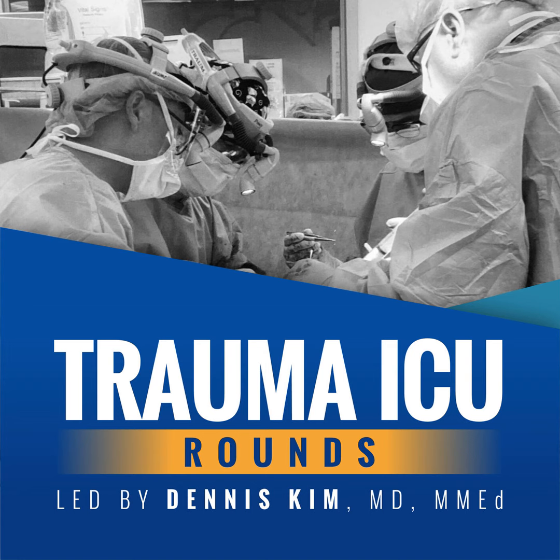So just to summarize before we go into the phases of a mechanical ventilator breath, the respiratory equation of motion is a great way of thinking about the variables that are involved in delivering or generating a positive pressure breath on the ventilator in order to ventilate patients. And again, the pressures that the ventilator must overcome are the sum of both the resistive pressure to airflow and the pressure to overcome the elastic properties of the lung.